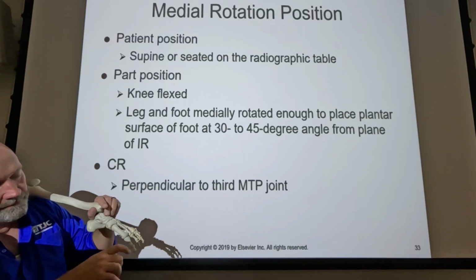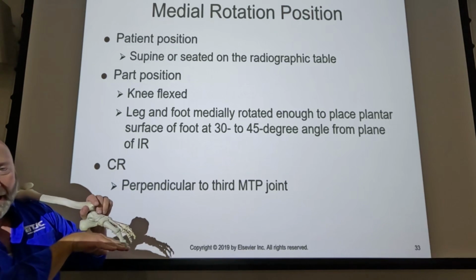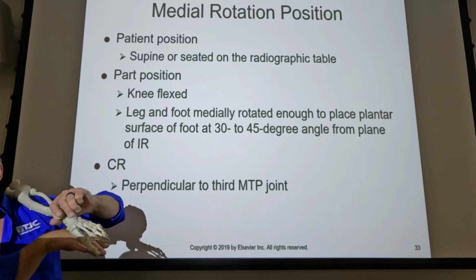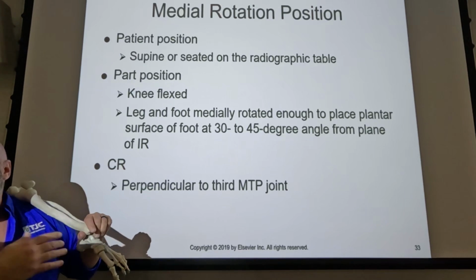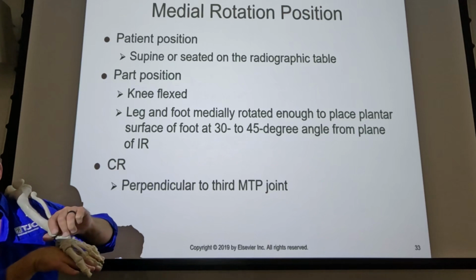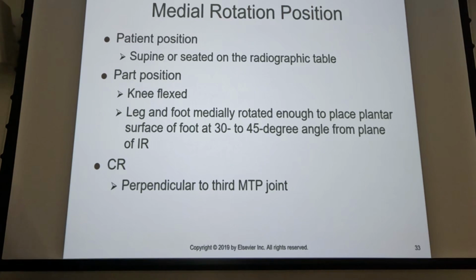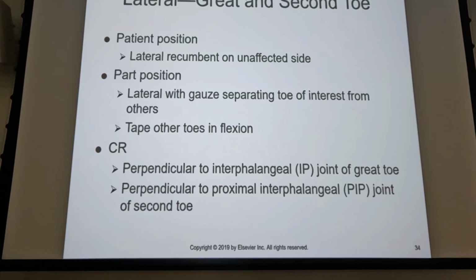Look at the shape of the foot. If it's a good wedge shape, the higher, that means it's got a good arch, right? So the higher the arch, the more rotation. So 45 degrees if the patient's got a real good arch. Not quite so high if the patient has fallen arches, or not fallen arches, but flat-footedness. Okay? So that's the reason for the wide angle there.